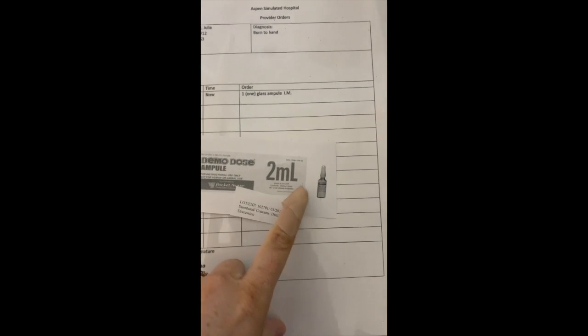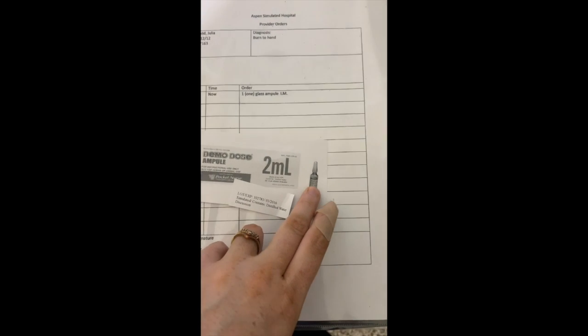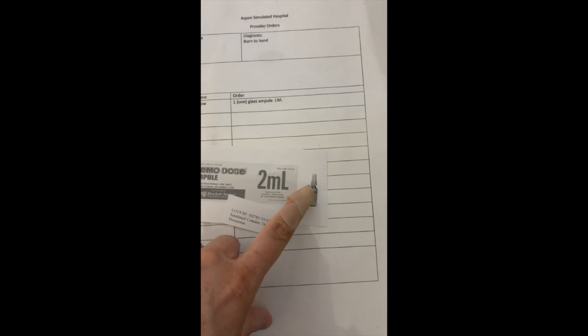Okay, today we have Julia Child, 12/12/12 is her date of birth, no known allergies. She came in for a burn on her hand. We're going to give her an injection from the ampule. With this, we'll have gloves on and a paper towel wrapped around it. We'll break off the top of this so that we don't have any glass lying around that can harm anyone. We'll draw up some medication. It looks like they only ordered 1 glass of it, and there's only 2 ml. So this will go either in her thigh or her glute.